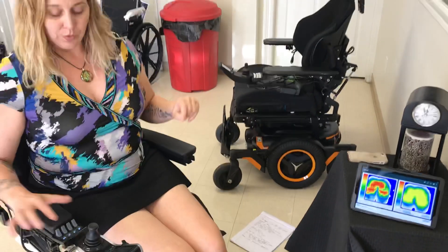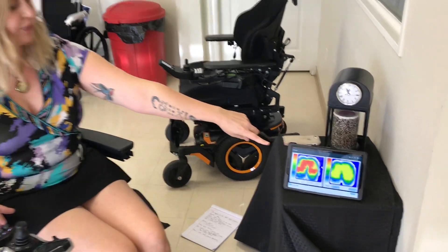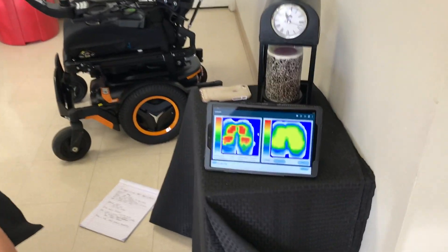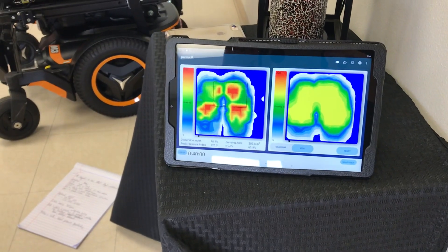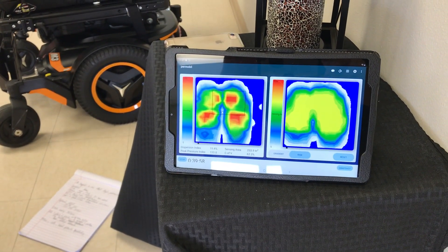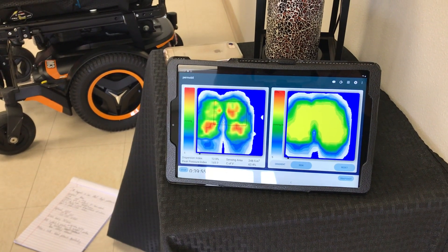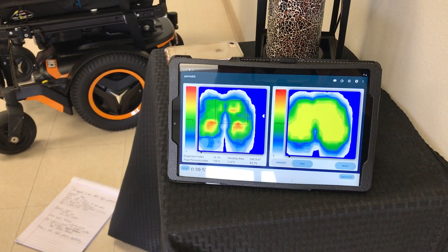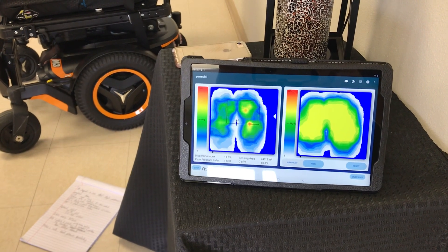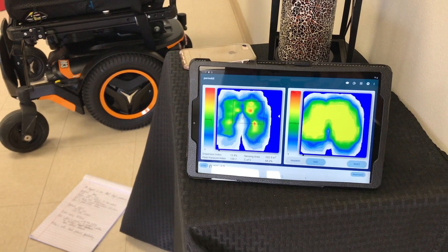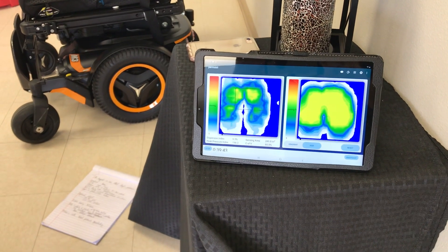When we go into tilt, you can actually watch and see how those areas offload. Just by going into a little bit of tilt, you can see that we're actually taking some of the weight off. It's recommended to do 25 to 45 degrees of tilt, and then we can do 110 to 150 degrees in recline, and you can see how much we are really able to offload.